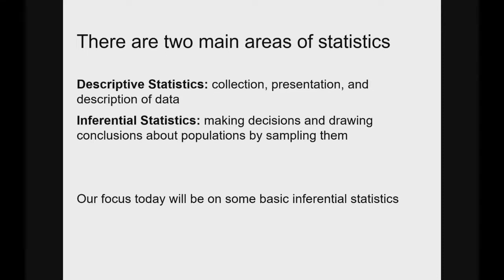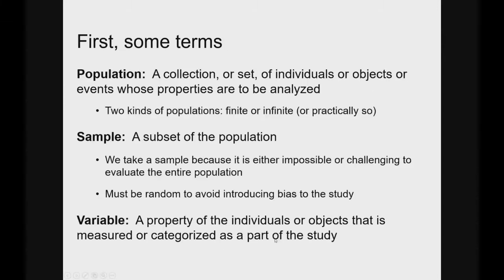Well, we want to be able to draw some conclusions about how this test functions on the entire population of lung cancer specimens by analyzing samples of lung cancer and then drawing conclusions about it. So we're inferring things about the population based on the data that we get. That's the main difference there. And again, the emphasis for today is about choosing the right statistical test, so we're focusing primarily on the inferential side of things.